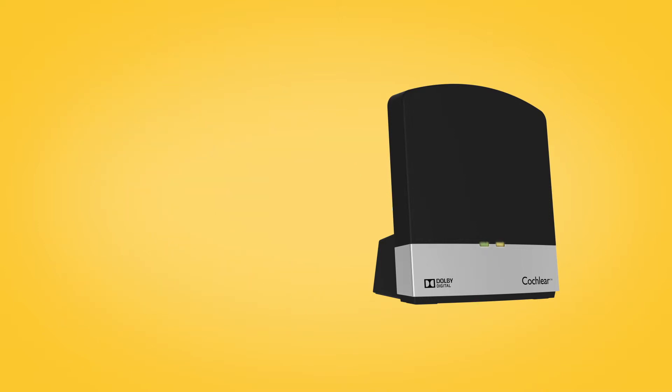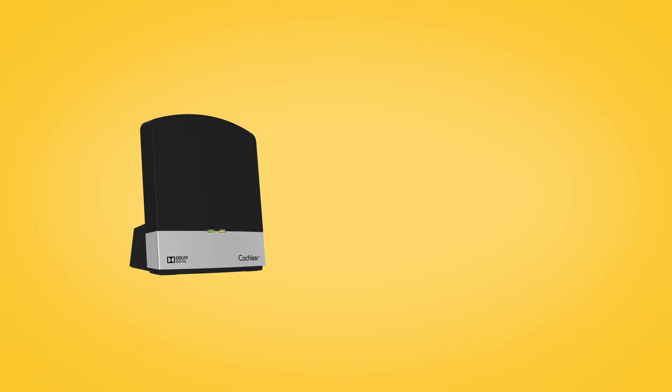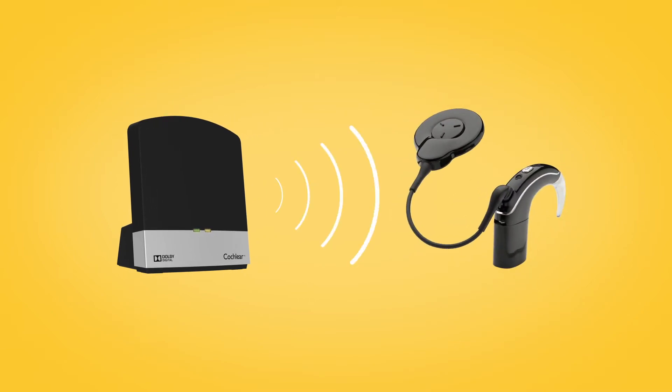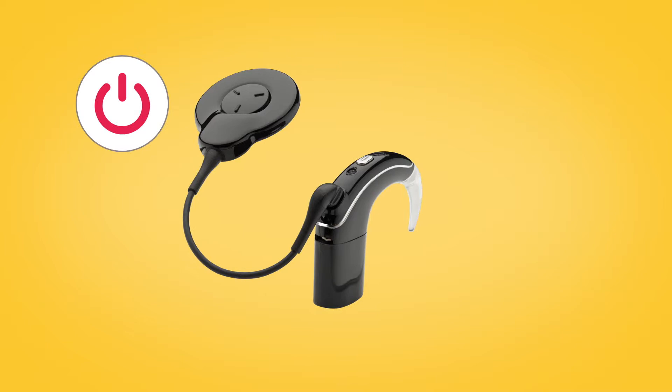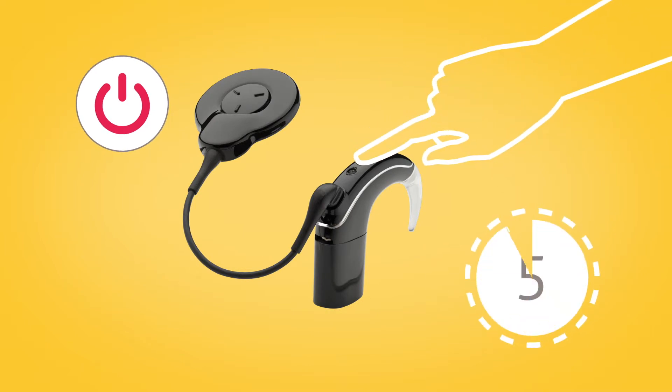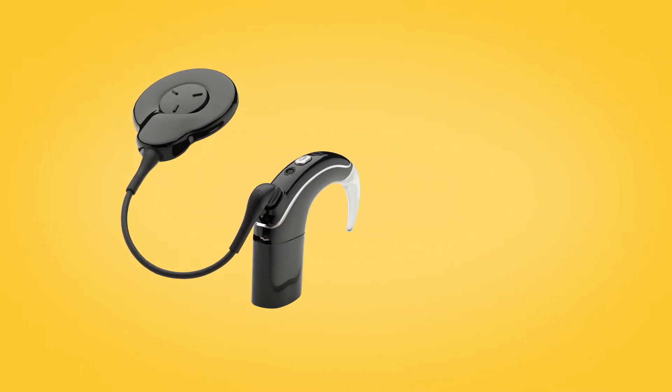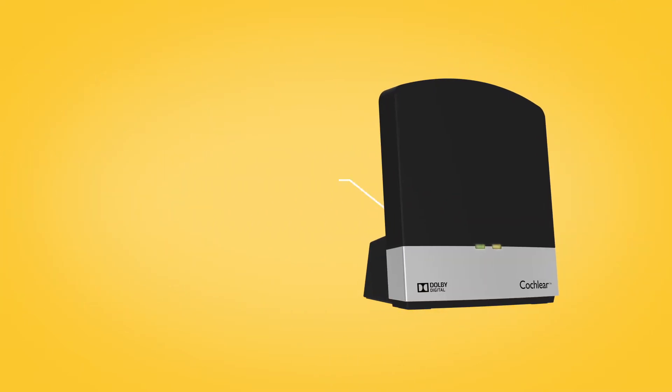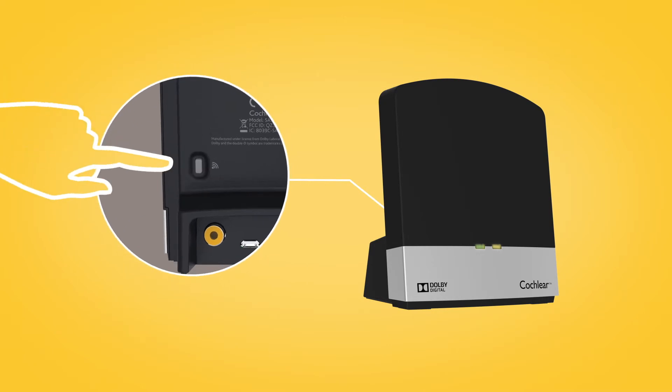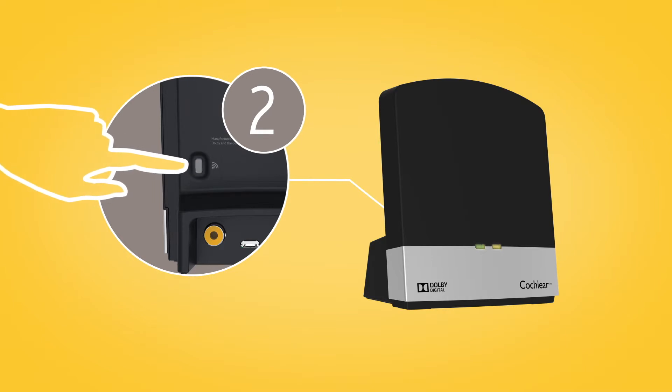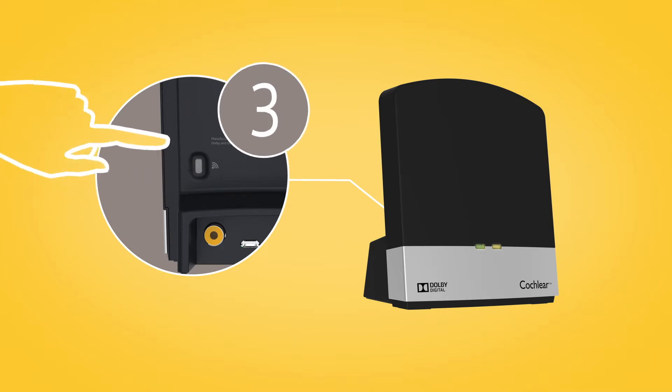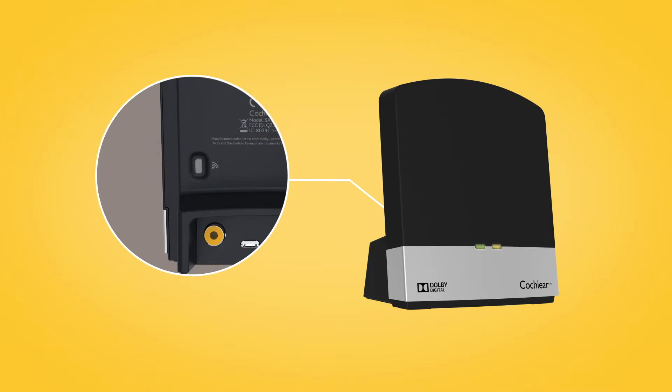To pair your TV streamer with your Nucleus 7 sound processor, remove and turn off your sound processor, then press the pairing button on the back of your TV streamer once, twice, or three times depending on which channel you want for the TV streamer.